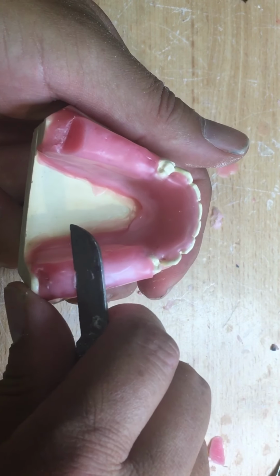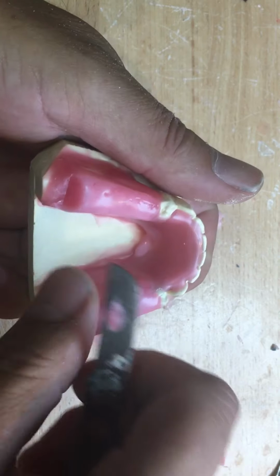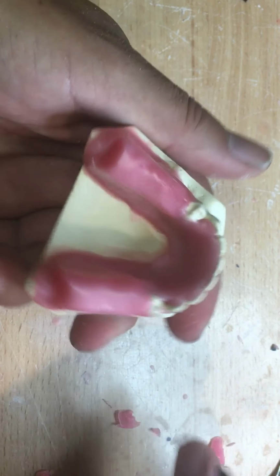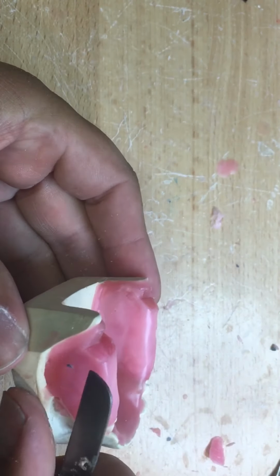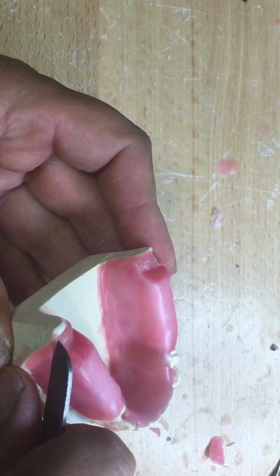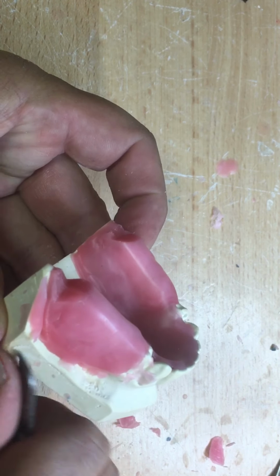We don't need to create occlusion on a retromolar pad back there. Even if we drop a bicuspid and just go two molars, we don't want any occlusion on a retromolar pad. Again, it's still soft, so I'm kind of shaping it. Putting a blue wax speck in it from the bit. Looks like that was from the sprue wax. It's okay. Keep it clean.